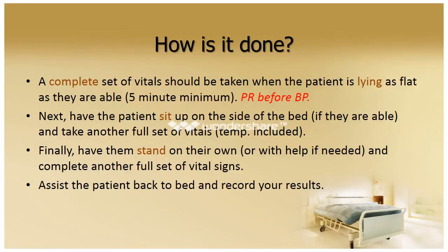So how is this done? Orthostatic vital signs need to be taken while the patient is lying, in a sitting position, and in a standing position. It's a good practice to get into to take your pulse rate before the blood pressure. In some cases, we may have patients that have COPD or congestive heart failure. These are patients that may have difficulty lying down and are unable to lie flat. We may have some patients that are significantly obese or have had surgery. Some patients with liver problems have a lot of fluid in their abdomen. Lying flat is very uncomfortable for them, and they may not be able to tolerate it.